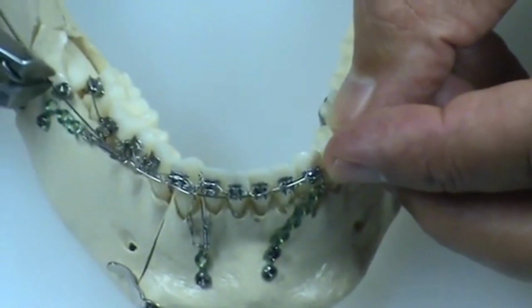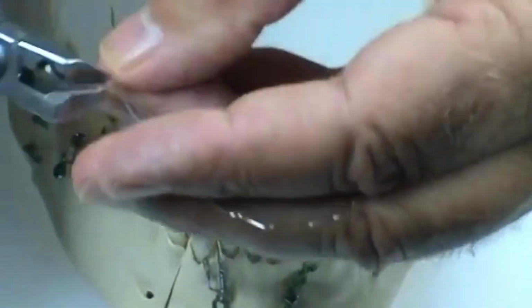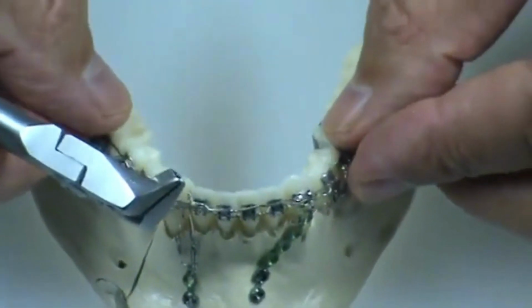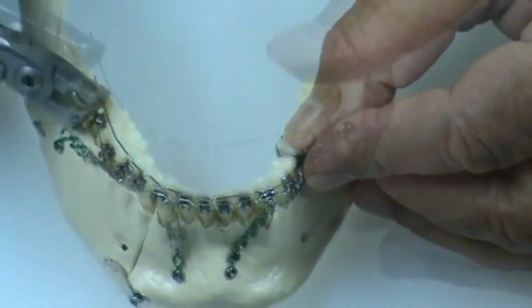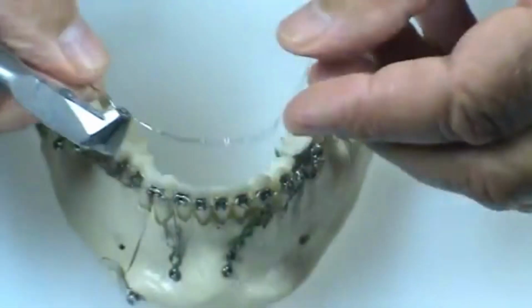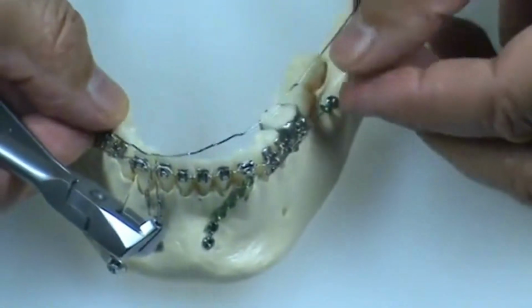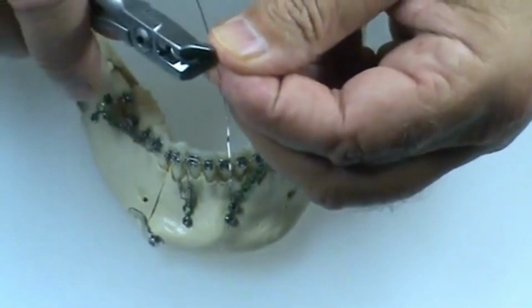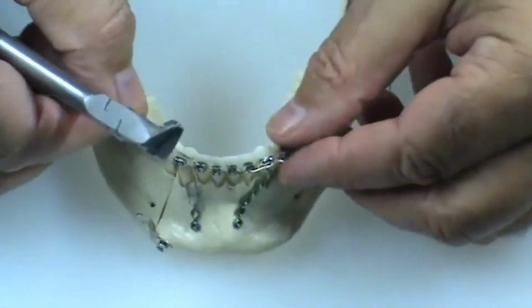Before I actually do this, I'm going to shorten this wire. It's bent in the mouth, and it's not going to be this long because you cut it last time. So I have a distal end cutter. I'm going to go ahead and cut the ends of the wire to the approximate location of where the wire would end, probably a little longer.